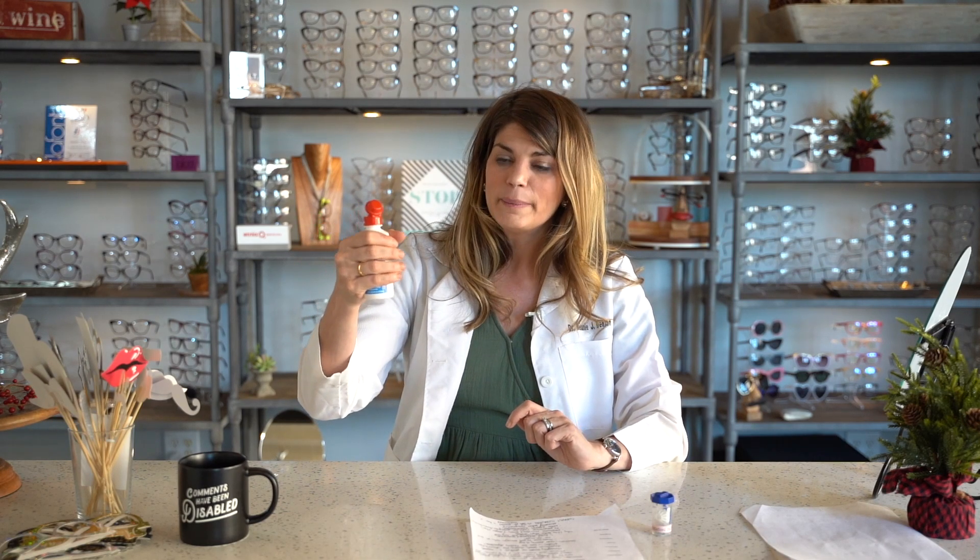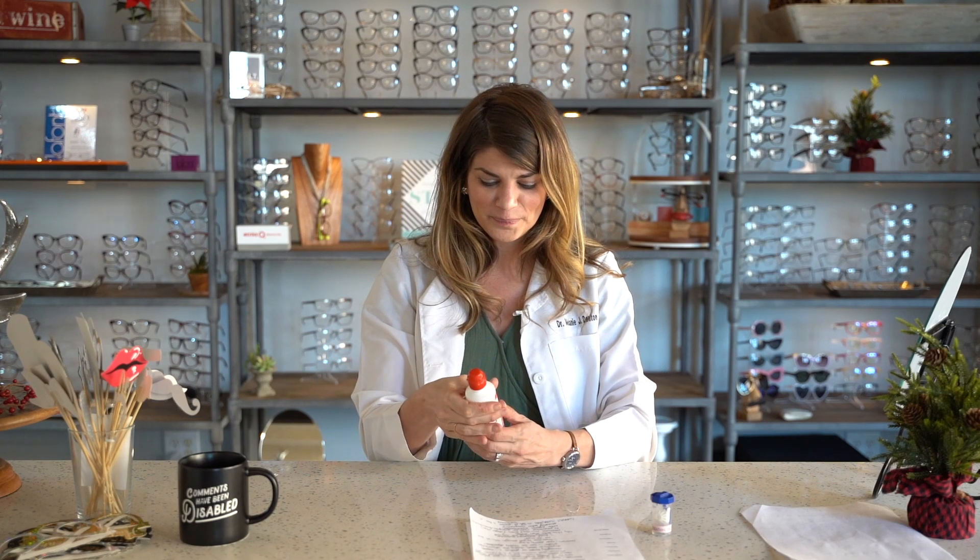Another thing about this bottle: you'll notice it's a little harder to squeeze than your average bottle. That's intentional — it's part of the design.